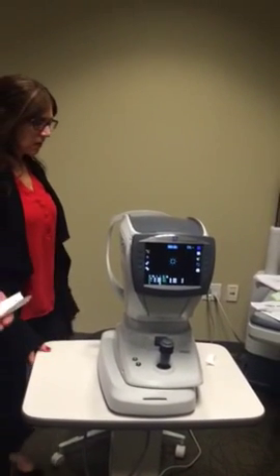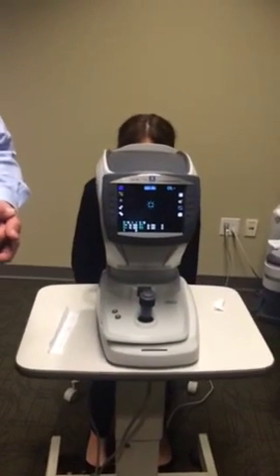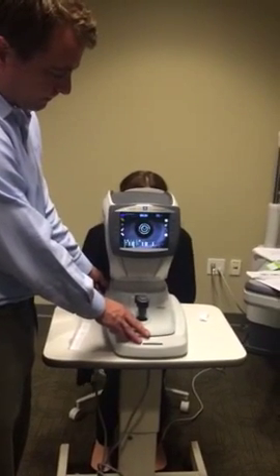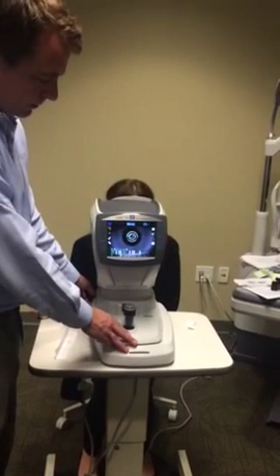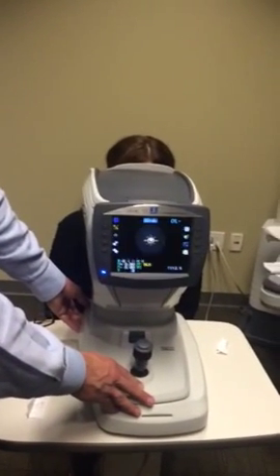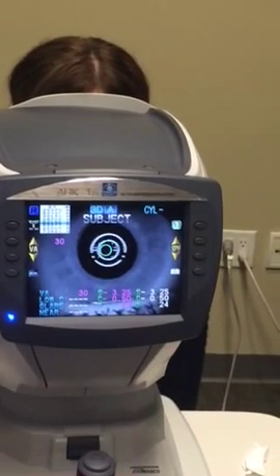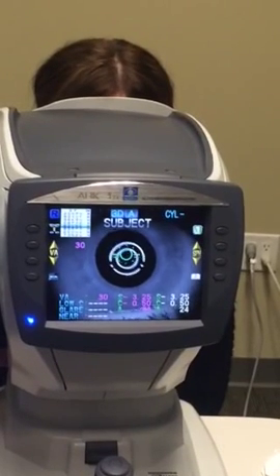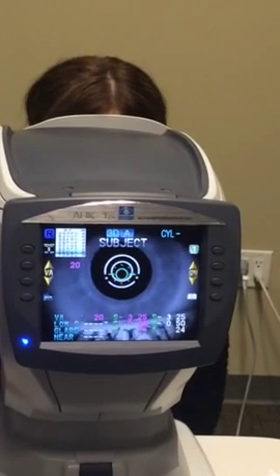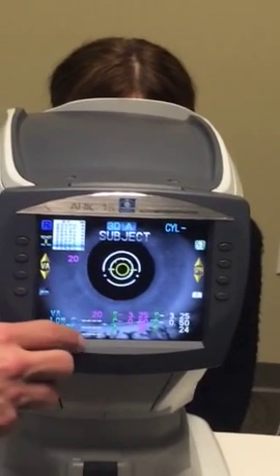If I'd like to take a glare reading, first let's get a reading. Go ahead and look right at the top of that hot air balloon. I can touch the visual acuity chart — can you read those letters? 6-2-C-N-K. How about those? Z-S-D-H-V. So now she can read 20/20 with the autorefractor reading.